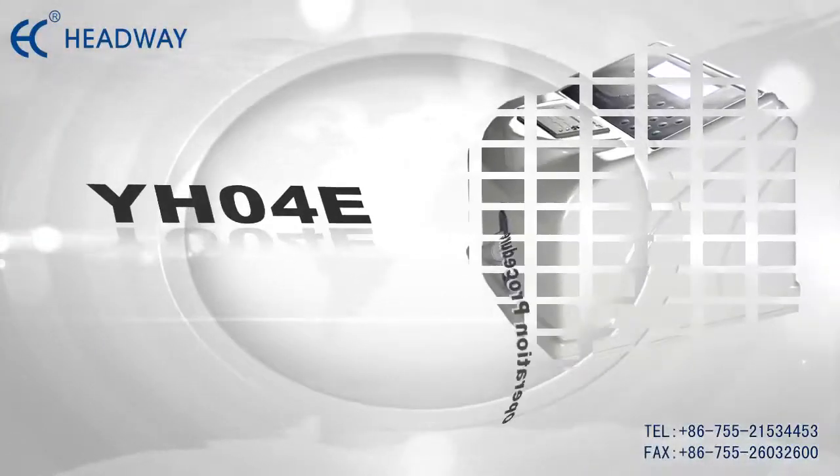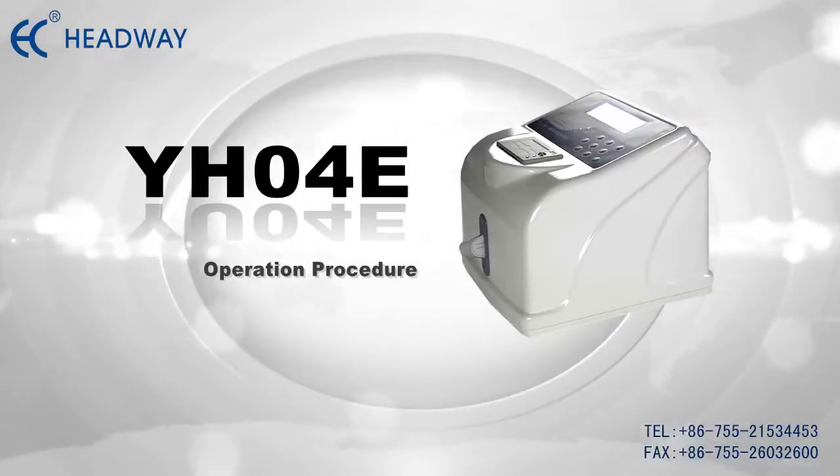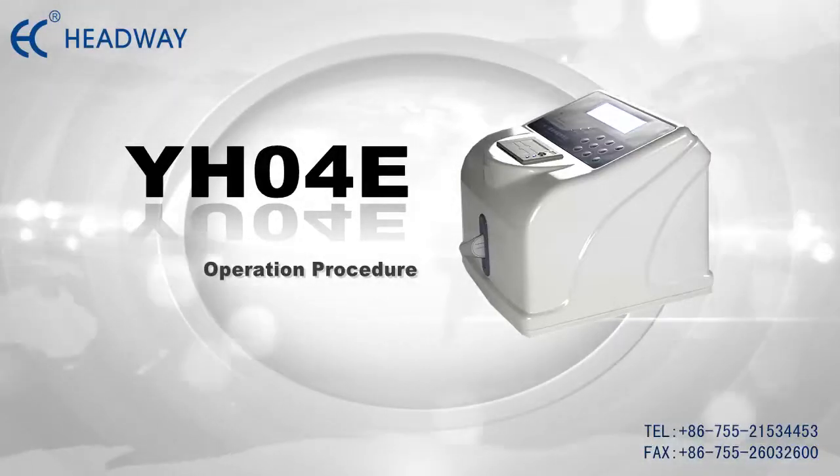Thank you for using the HEADWAYS YH04E Helicobacter pylori detector. In this video, we will introduce the functions and show you how to operate and calibrate it.